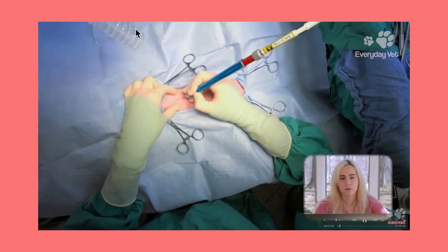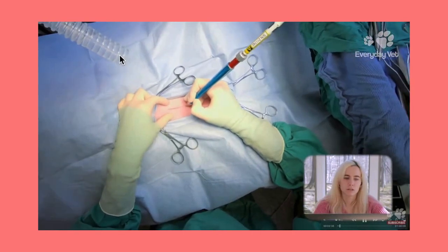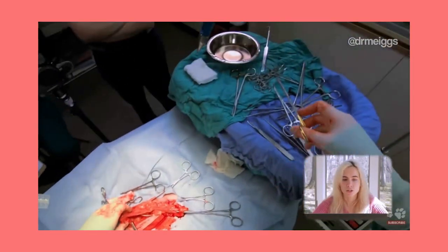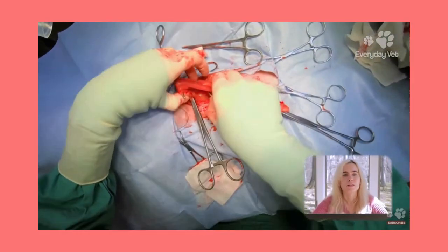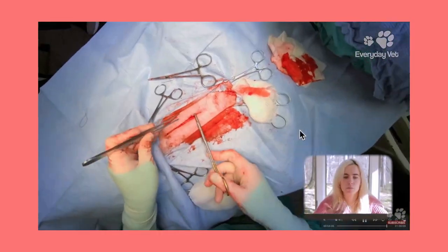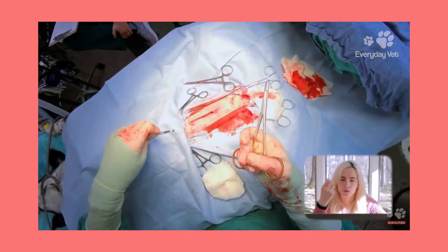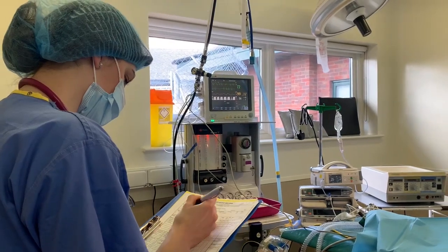Here is a brief overview into what the procedure looks like. We incise into the abdomen and then locate the uterine horns and uterus, ligate them and then remove them respectively. After we check that our ligatures are secure and no bleeds are detected, we close up the muscle, subcutaneous and skin layers.